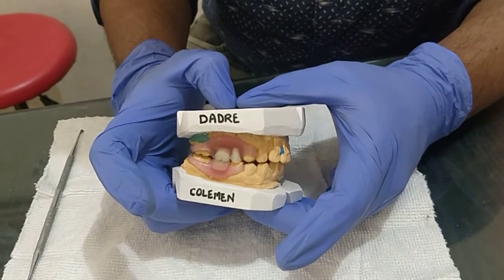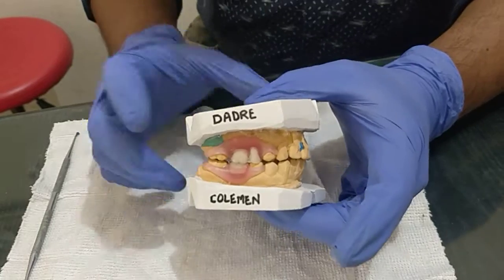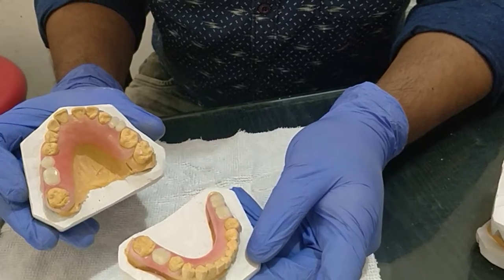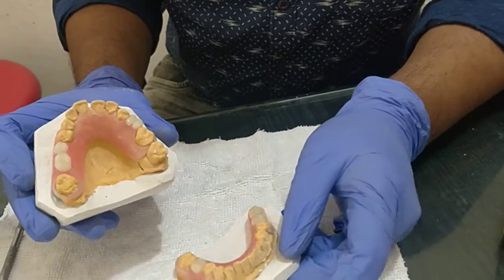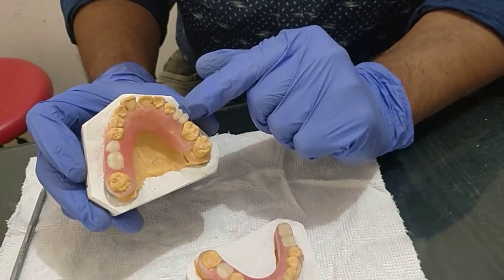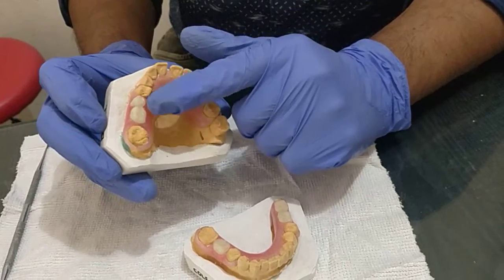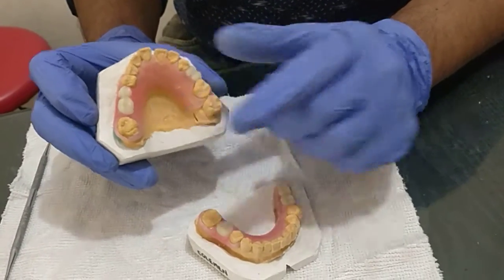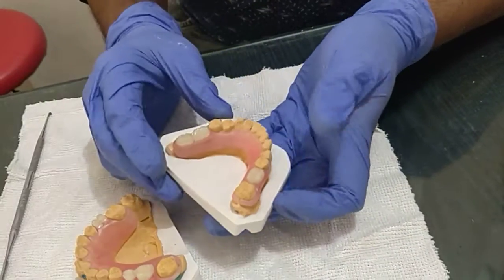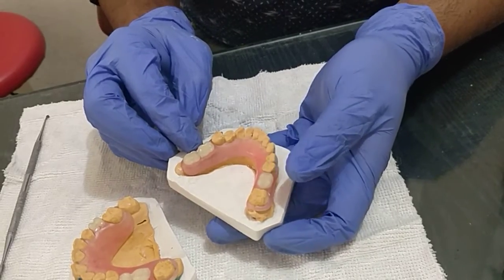I have made upper and lower flexible dentures for my patient. This upper flexible denture consists of two units: premolars on the left hand side, and the second premolar and first molar on the right hand side. For the lower, both molars are missing on the left side and one first molar is missing on the right side.